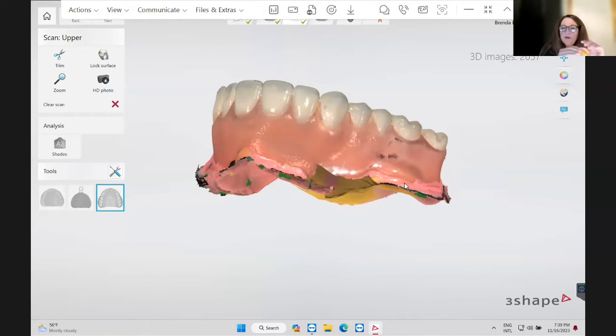And if you are opening up their vertical, you are going to want to just put a little bit on the occlusal. I usually do first molar, first bite, and then we're going to scan the bite on your first bite to the anterior on each side. Because if any of your material, your blue mousse bite, your composite little block or wax block that you're opening their vertical, if you're trying to scan that to get a bite, your bite's not going to correlate together. And then you're going to have to manually do it. I trust a lot of times the computer, the Trios, to correlate it together instead of me manually, because if you put your dot just a little bit off, it can make your bite off.